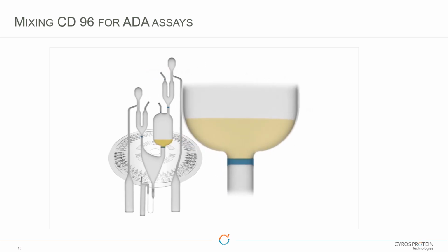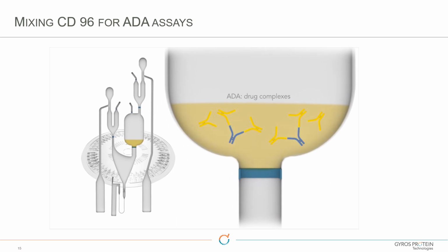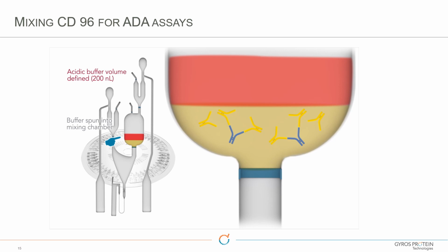And now we're adding our master mix with the labeled capture and detection reagents in a neutralizing solution that will bring our pH back to normal and allow for reassociation to occur.